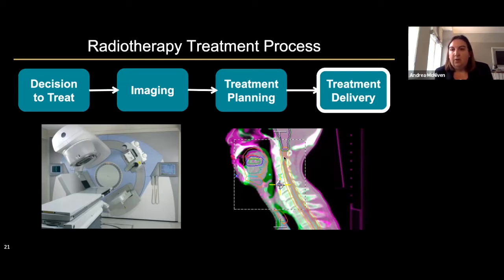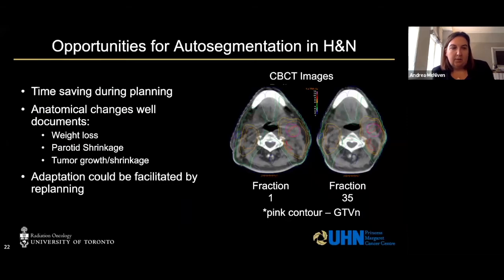These will really drive the therapist to be able to match the patient and flag any concerns to the oncologist or the physicist, to see if we have to do any further assessment or if we have concerns about how safe the treatment continues to be. So this is a critical tool as well, those contours, in assessing the patient throughout the long course of treatment. So that is an overview of how the contours are used throughout.